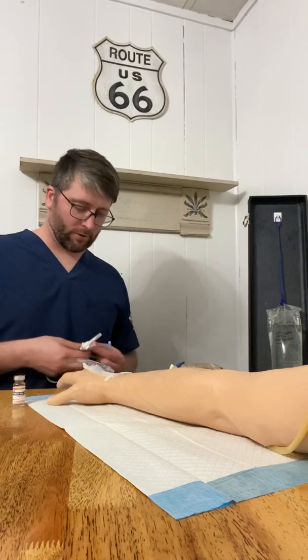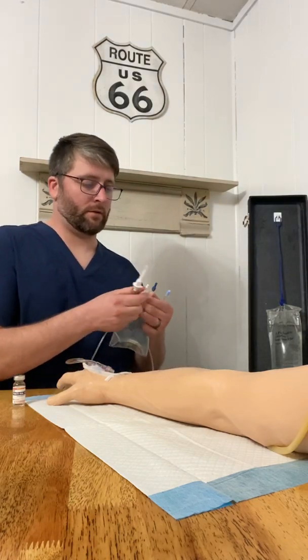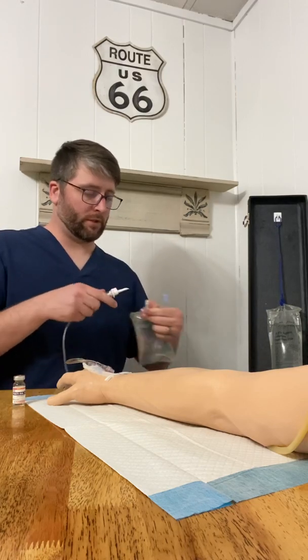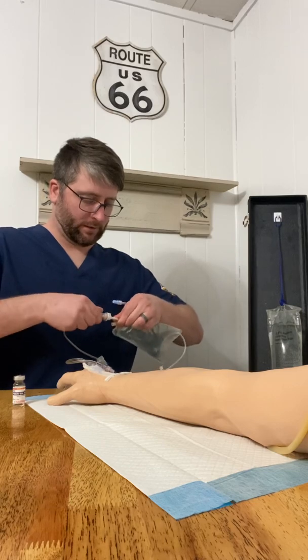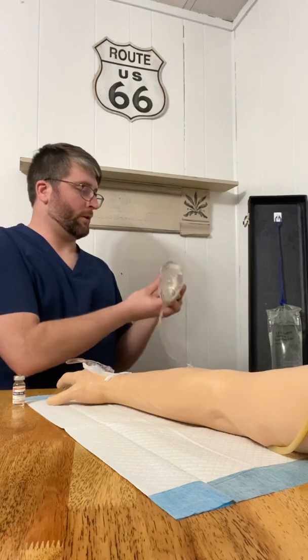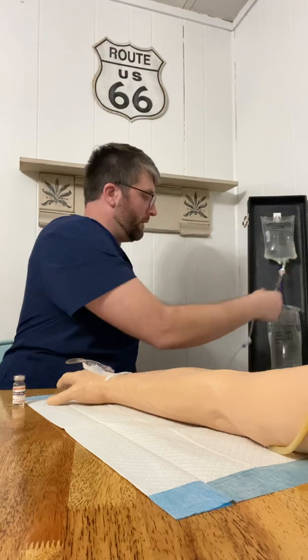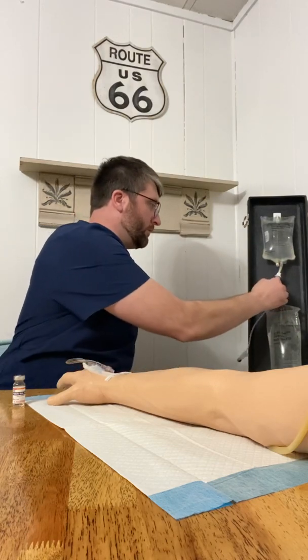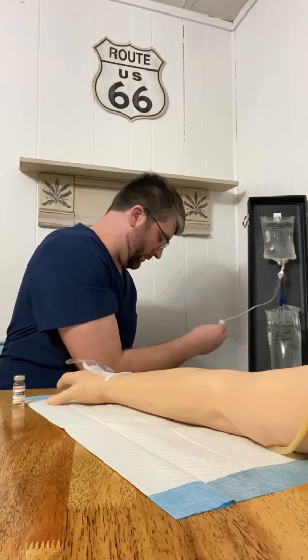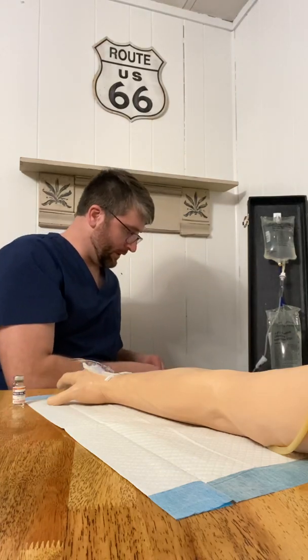So there we are. We're going to close our roller clamp. Then we're going to open up our bag. We're going to open up our spike. Maintain aseptic technique. Twist as we're going in. Then we're going to hang that. Then we're going to squeeze that. Make sure it's about a half. Then we're going to prime that line. Very little fell out.